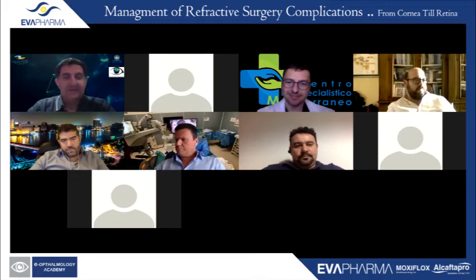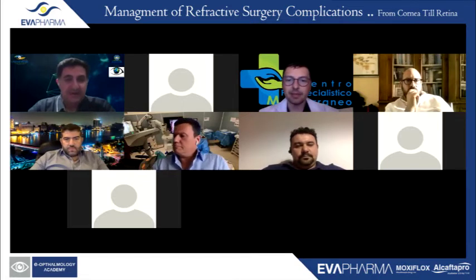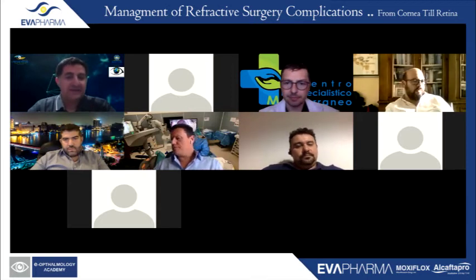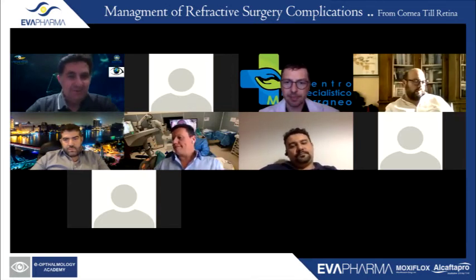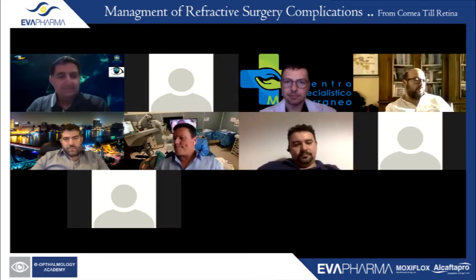And we found this for many years in our center at Al-Watani Eye Hospital, because it was not centrally having the same current. And we noted this problem, that the post-operative result of the right eye was different from the left eye. We managed it in the last years, because we didn't know why the left eye always had a not-good post-operative correction.